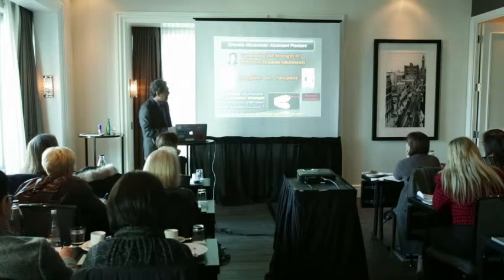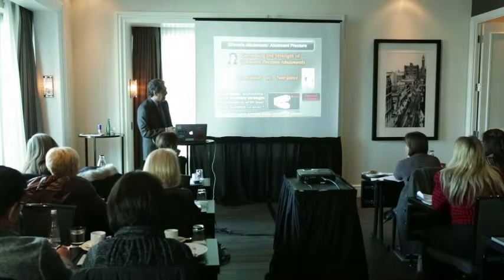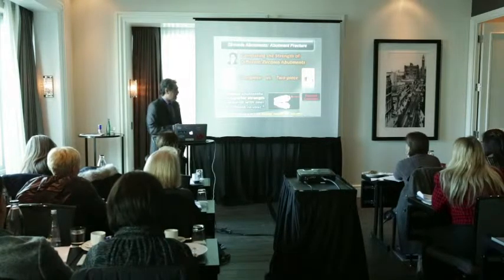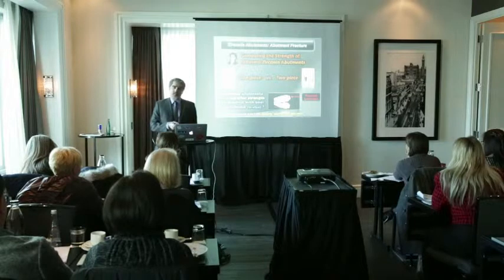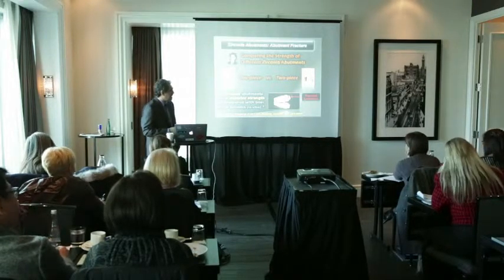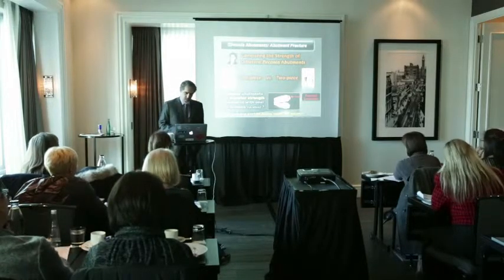And most of the time, the connection between the abutment and the implant would fracture, and that was one of the main observations that Dr. Saylor could record and report.